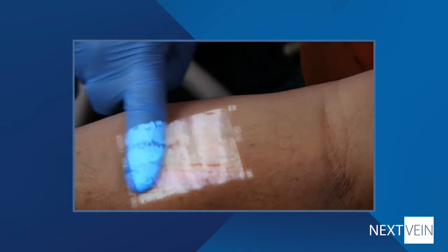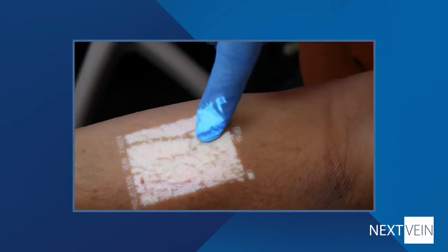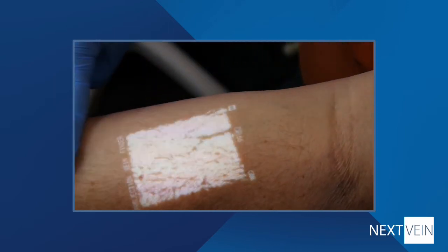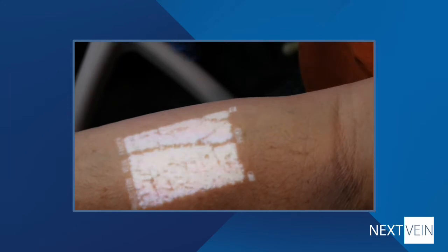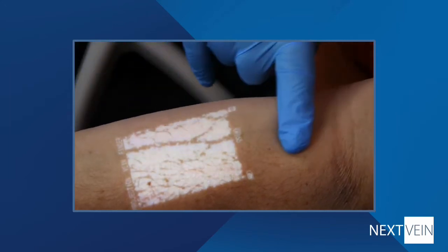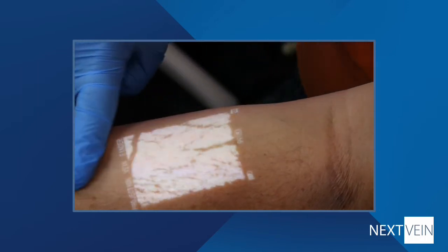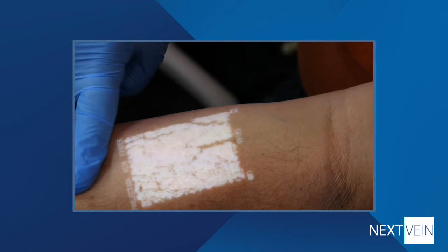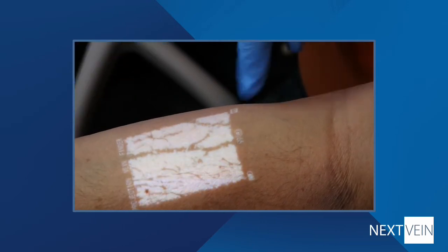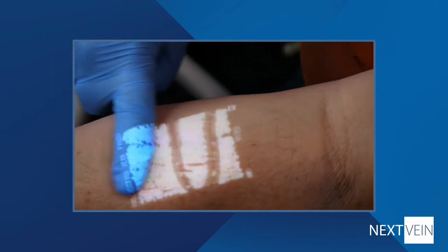A useful approach to verifying vein patency is called the wipe technique. Properly used, this can help you verify blood flow in the selected vein and show you where the valves might be. The general idea is that by pushing the blood out of the vein, it will disappear from the projection. When you allow the blood to return to the vein, it will refill and then reappear in the projection. The device detects the hemoglobin in the blood that's filling the vein, not the vein itself. That's why this works.